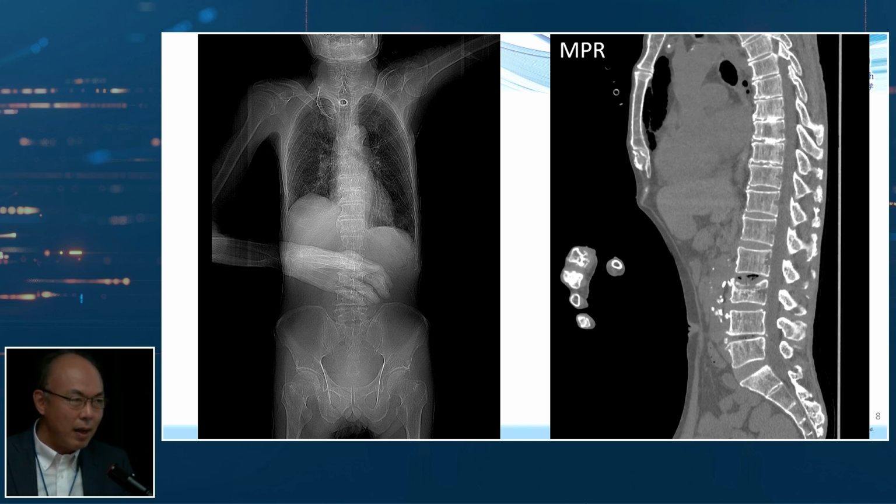Everyone says we always see the axial image, and it is very difficult to see spine compression with only the axial image, but very easy when we reconstruct the sagittal image. But in our clinical routine, we usually don't make MPR like sagittal or coronal. We only read the axial CT, and if there is no abnormality, we always finish the case.